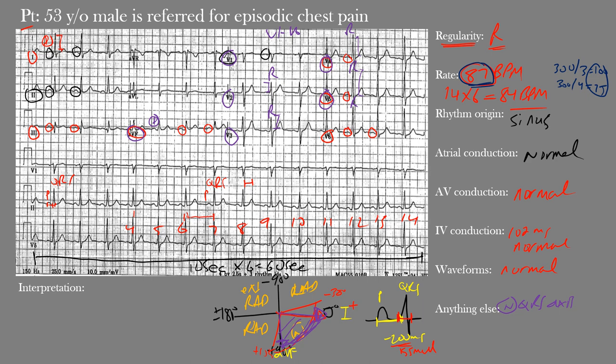Our final interpretation: this is a regular sinus rhythm at a normal rate of 87 beats per minute — within the normal adult range of 60 to 100 — along with normal atrial, AV, and intraventricular conduction, and no other waveform abnormalities. QRS axis and R wave progression are normal. This is normal sinus rhythm. Our 53-year-old male referred with episodic chest pain has an EKG showing normal sinus rhythm — nothing to be too concerned about from this EKG.